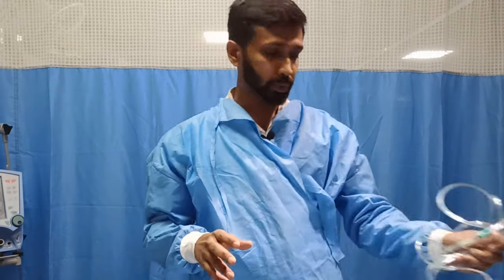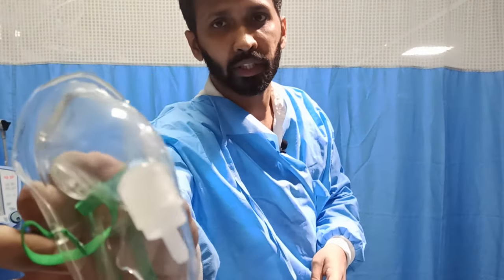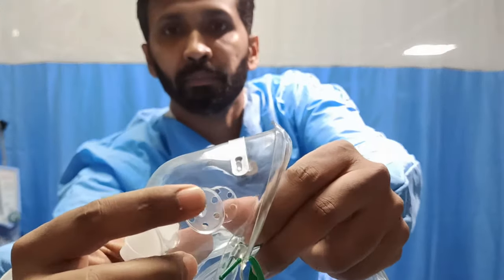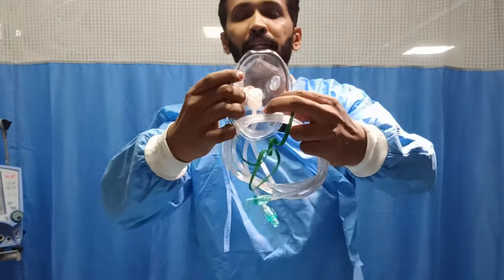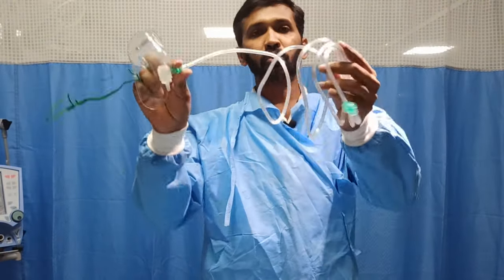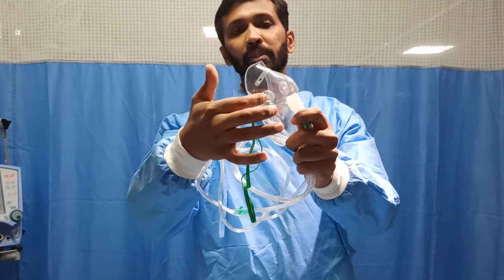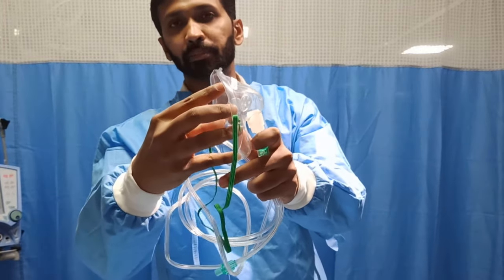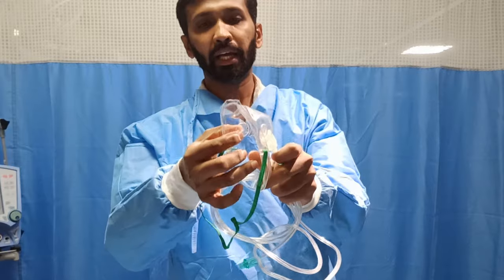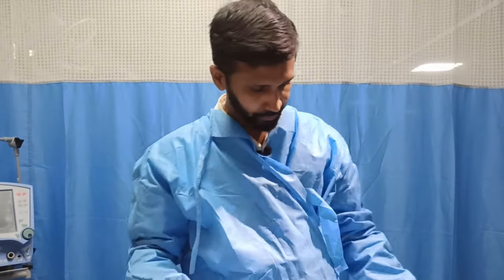The second thing we use is the normal mask. As you all know, this is the normal mask. This normal mask has some exit ports and some airway here, so that once the oxygen comes through these tubes, air is taken from this side, and a mixture of air and oxygen is created in this space in our mask, in front of the nose. Okay, this is the oxygen mask.